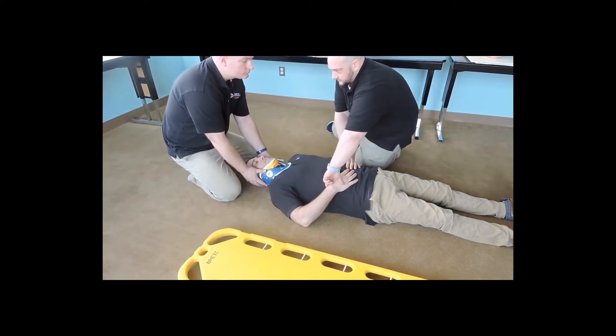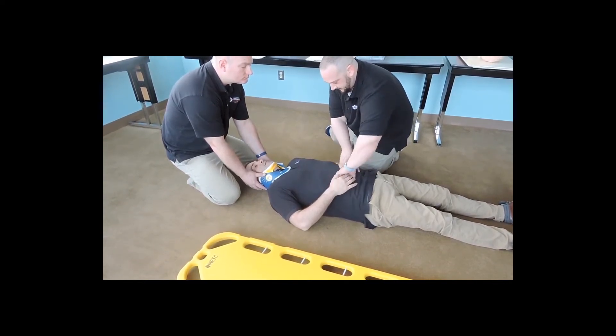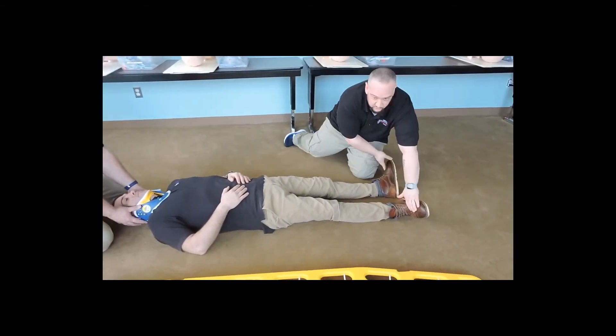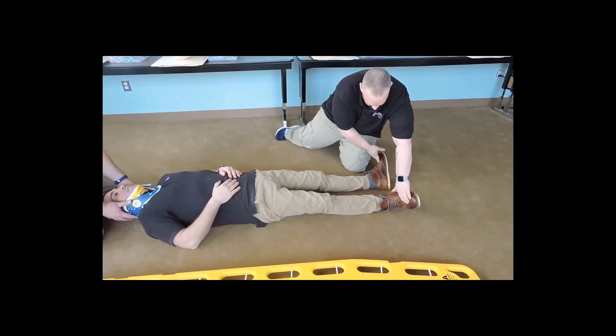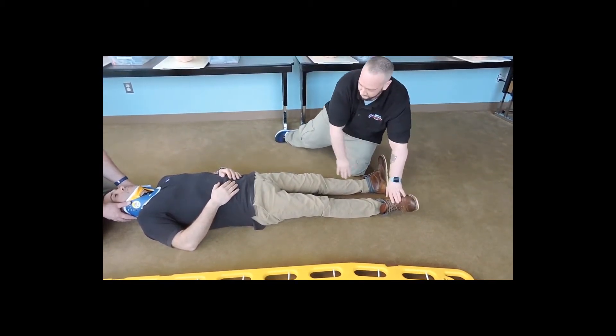I'm going to reassess pulses — good strong pulses, even on both sides. Can you feel me touching you, sir? Still the same? Can you squeeze my hands? Checking the pedal pulses again, shoes removed. Good strong pedal pulses. Can you feel me touching you, sir? Same on both sides? Can you wiggle your toes for me again?